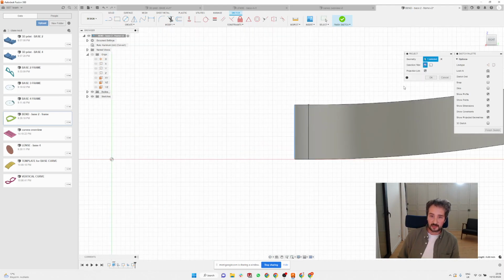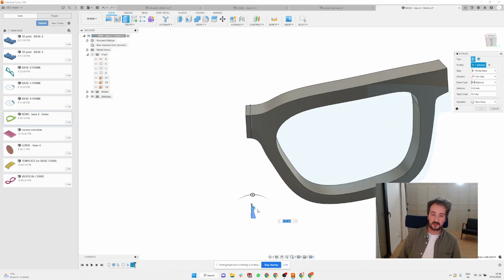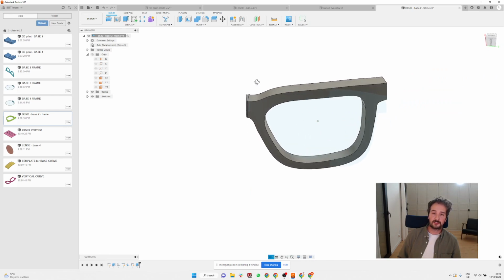Project this line and create basically a little cut in, let's say, a 5 degree angle. No, let's say a 10 degree angle, and extrude that. Then I'm going to cut that thing, I'm going to cut it out. And now it's not going to be base 4. I'm going to show you now.